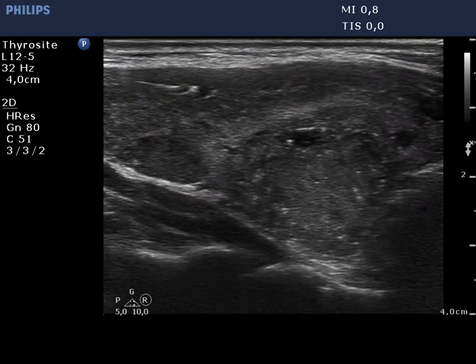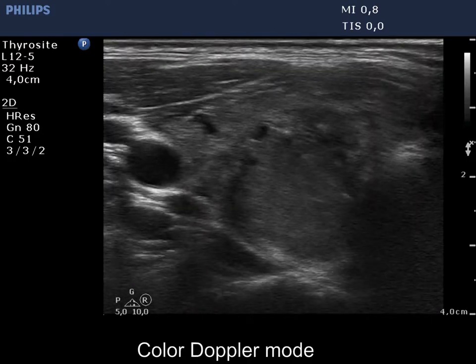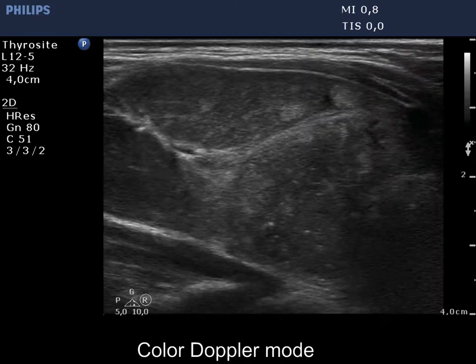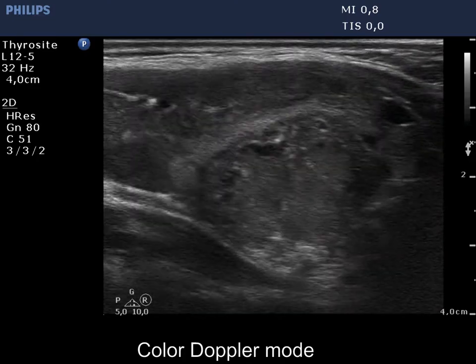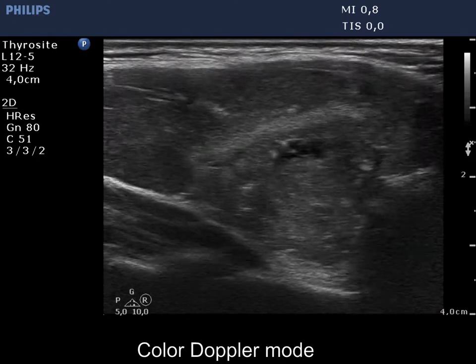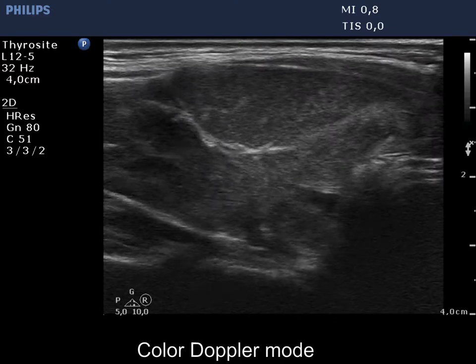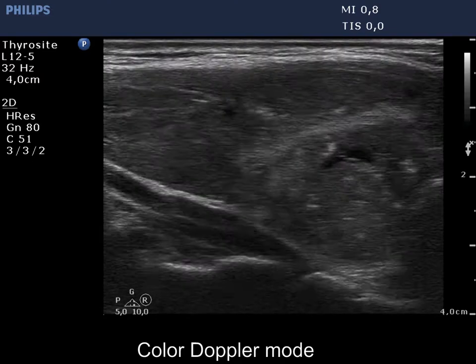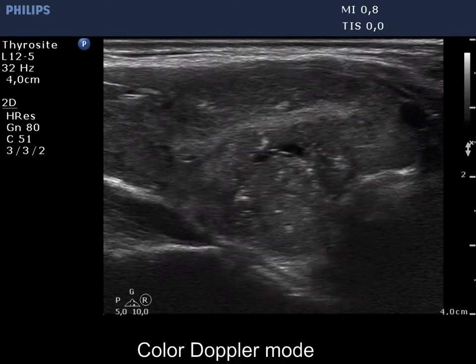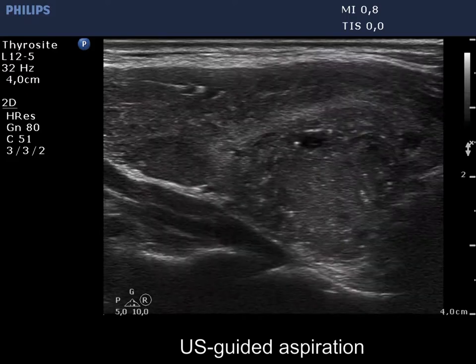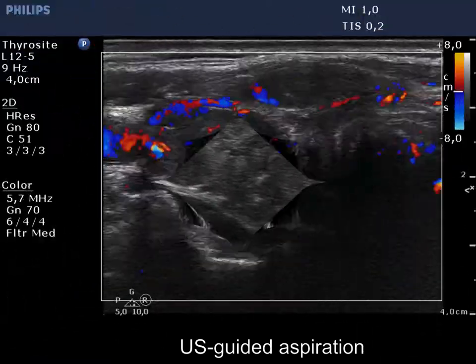The borders are ill-defined and the shape is not regular geometrical. The dorsal contour of the tumor is abutting, but at this part of the tumor the capsule is continuous. On the other hand, the capsule is invisible at the medial part of the tumor.